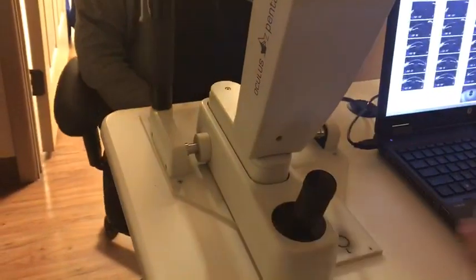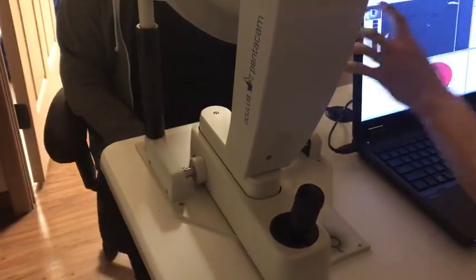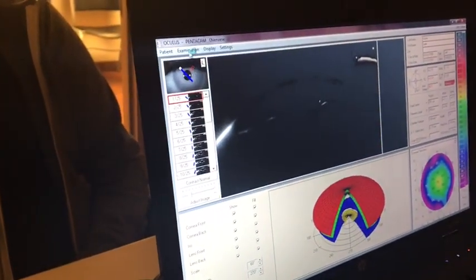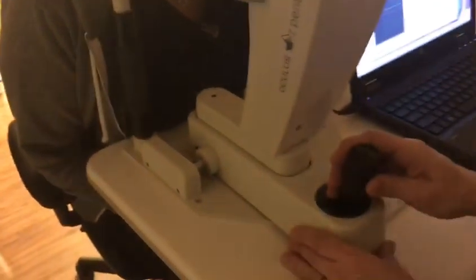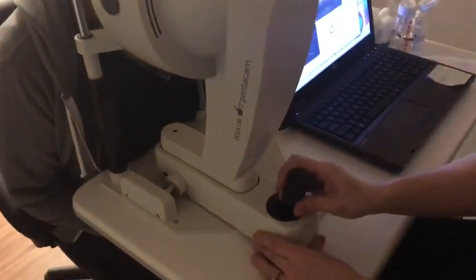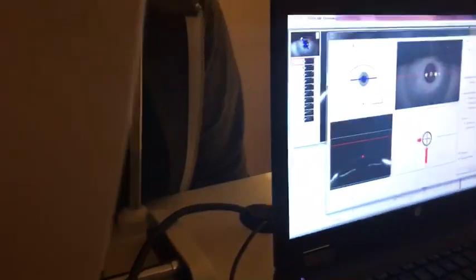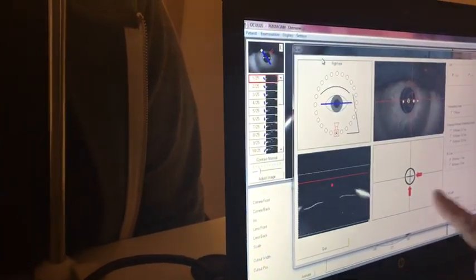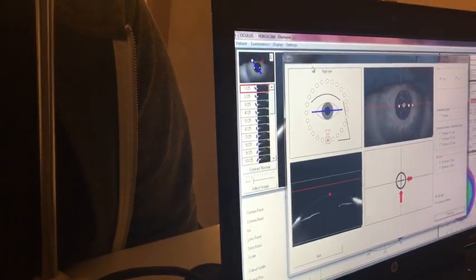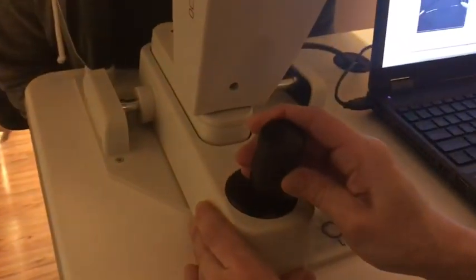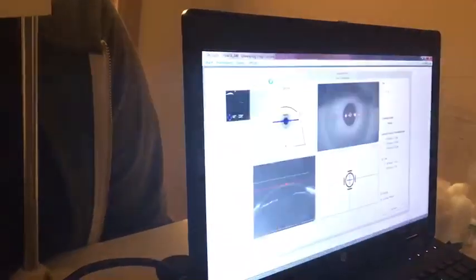And then you're going to pull back, go over and then you go to examination, scan. And you do the same thing to the other eye. Go ahead and rest your chin back in there again. Forehead all the way forward. And once you follow the instructions the joystick tells you to do there. And try not to blink or move whenever it starts to spin. Takes about four seconds. You can lean back.